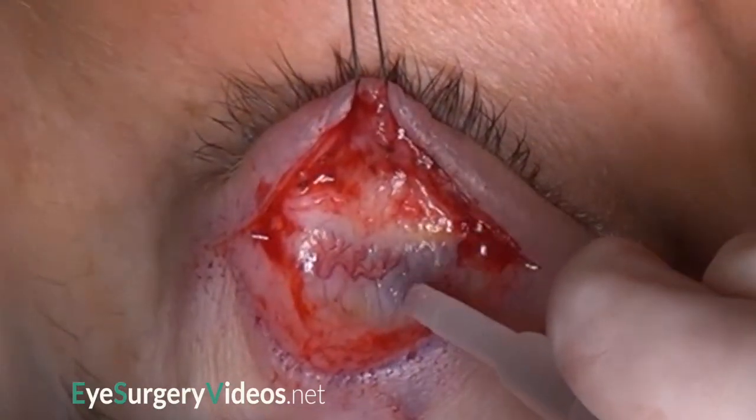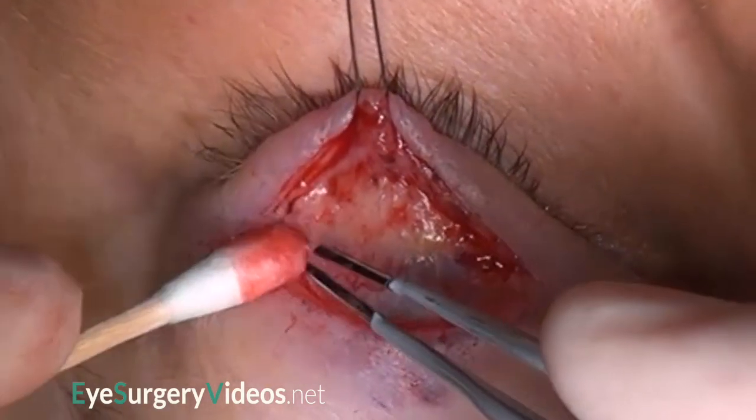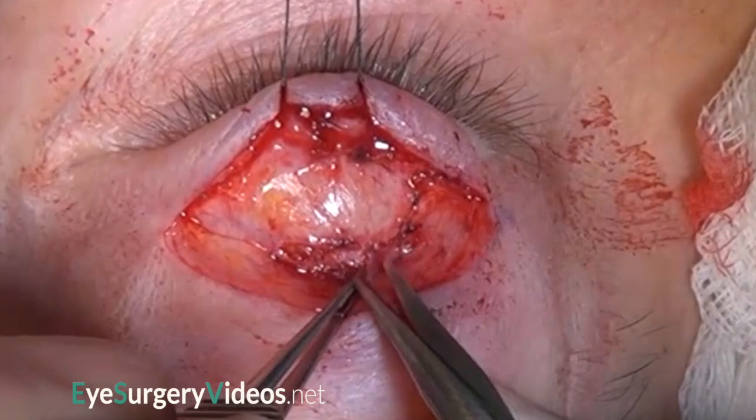Muller's muscle will be transected and can bleed profusely. Therefore, a line of cautery is placed. This can be a little uncomfortable to the patient, which is improved with a drop of topical anaesthetic.